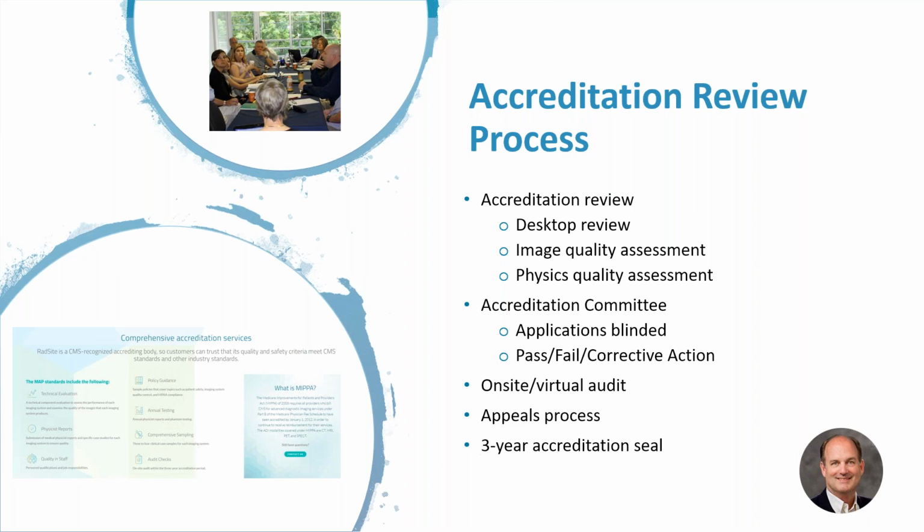And one of the taglines I like to say is that, in accrediting for 25 or thereabout years, over 5,000 different organizations, no company's gone through any of the accreditation programs that I've helped run without making at least one substantive change. And the goal is really to identify opportunities for improvement and use this as a reflection point for any organization, in this case, a ConeBeam CT imaging provider, to make sure they're shoring up their workflows. As Dr. Powell described, basically the key benchmarks of process, structure and outcome measures.